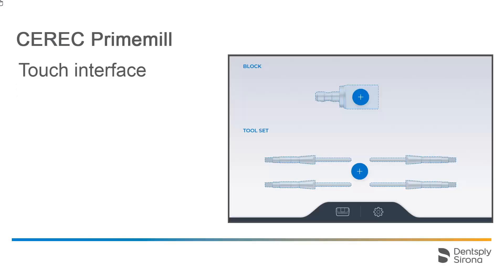Here you see the start page of the CEREC PrimeMill Touch interface. At the lower edge of the screen, you'll find the button that will take you to the Routine Actions.